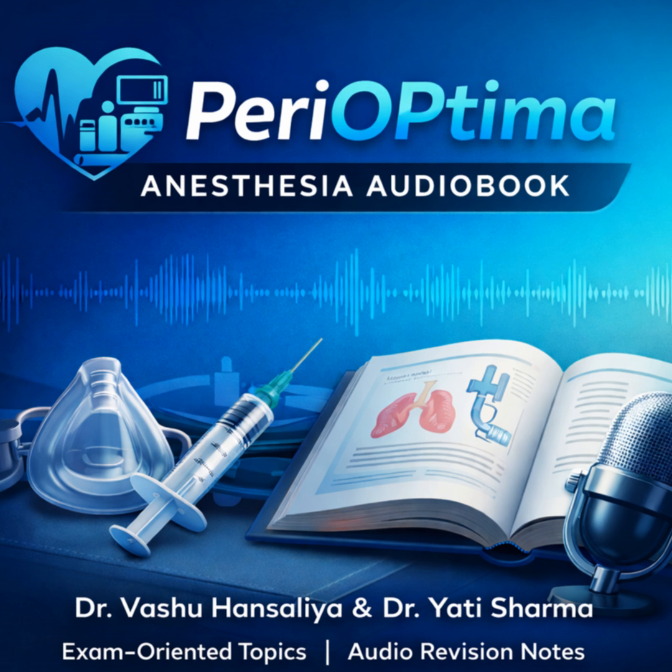5, SpO2 lags. Capnography is real-time ventilation. 6, static CVP is poor for fluid responsiveness. Use dynamic parameters like PPV or SVV if the patient fits the criteria. Good. 7, lactate clearance is a better prognostic marker than a single lactate level. 8, in ICP monitoring, P2 greater than P1 means dangerous brain swelling. 9, the difference between PIP and P-plat tells you about resistance versus compliance. And 10, safety first: check alarms, use sterile technique, and zero your lines. That is a solid summary. If you can articulate that in your exam, you will pass.